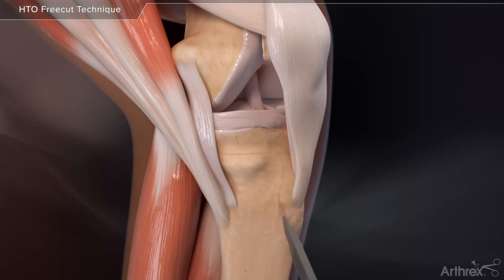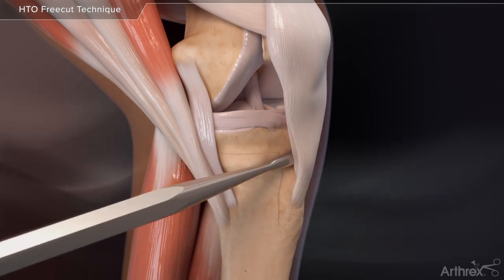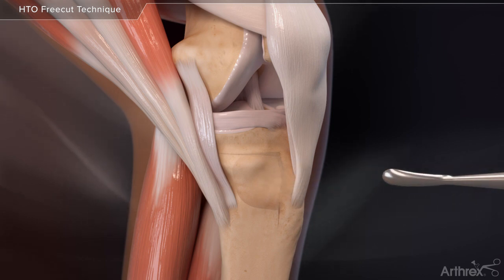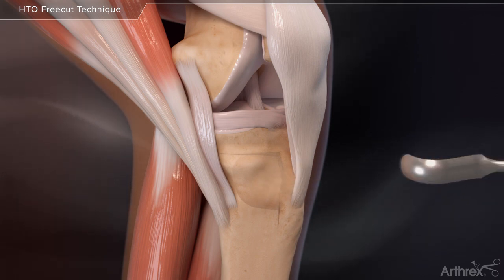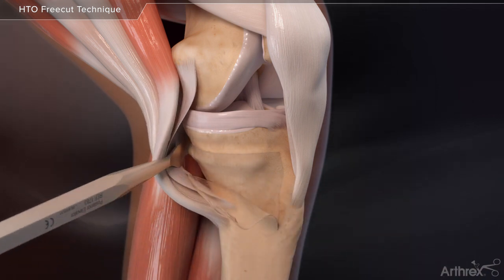Care should be taken to elevate the patellar tendon and to completely release the tibial attachment of the superficial MCL. The posterior elevator can be used to strip soft tissue attachments from the posterior medial aspect of the tibia.